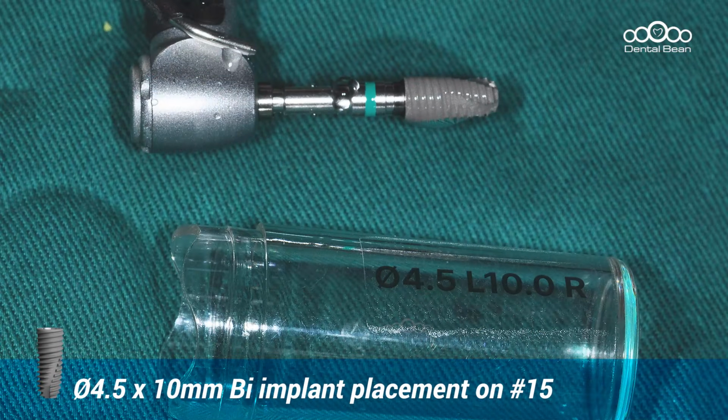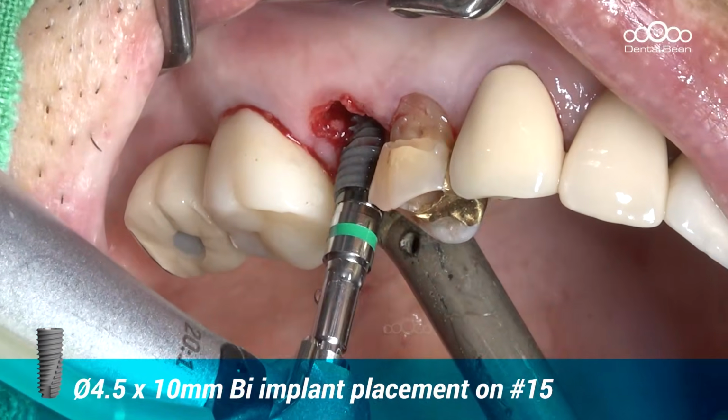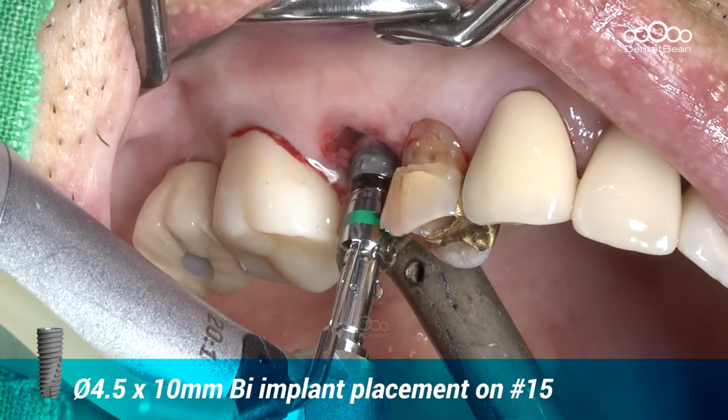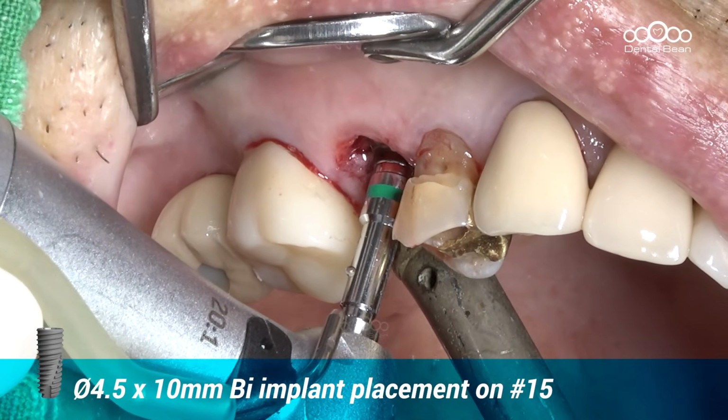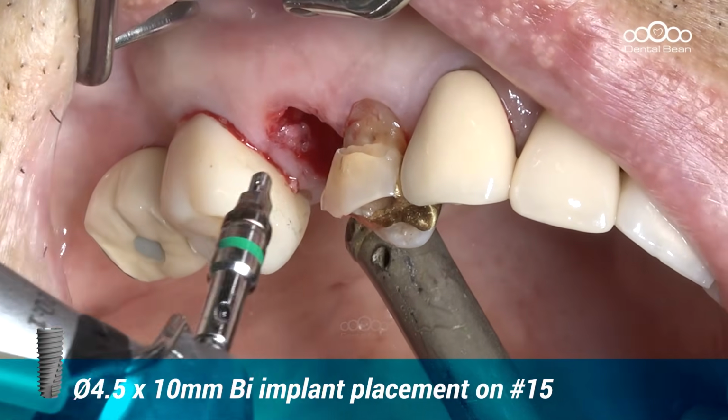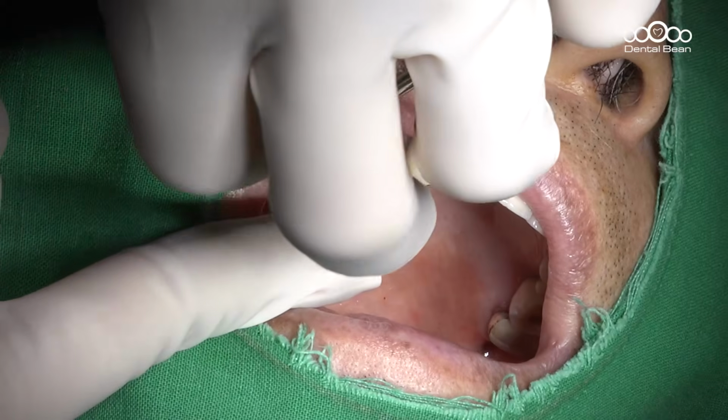A diameter 4.5 times 10 millimeters BI implant is now being placed. Even in premolar cases like this, when the apex and sinus are very close, the apical bone must be reduced so that the implant slightly protrudes toward the sinus, which allows easier achievement of primary stability.